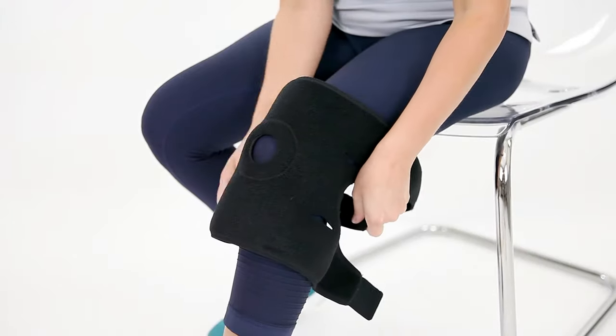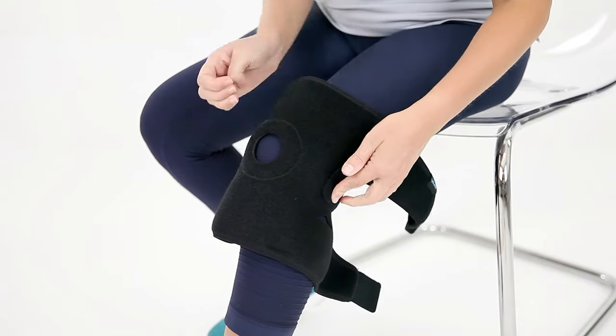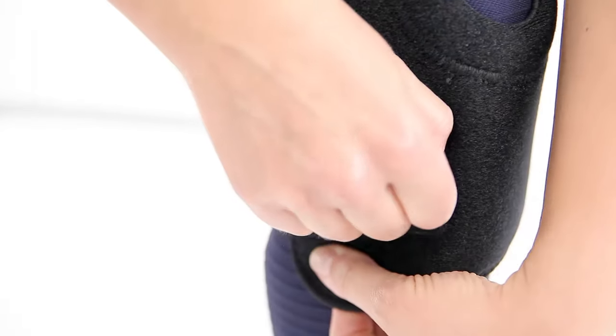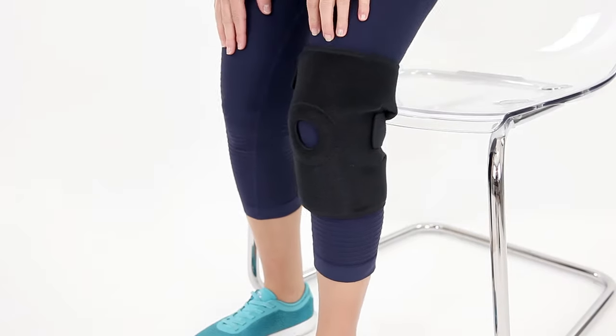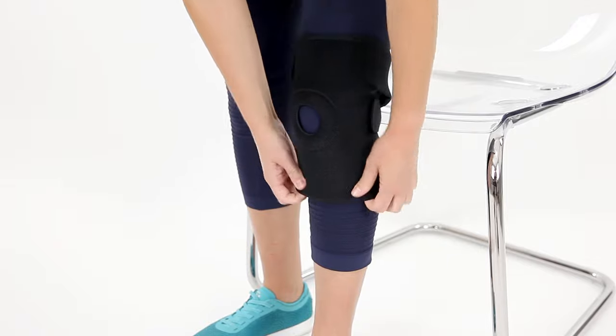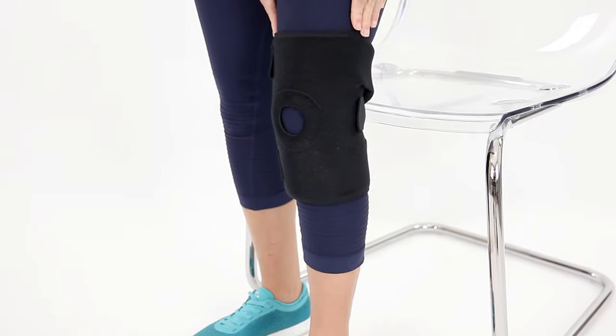Wrap the top strap above your knee and the shorter strap below your knee and secure in place with the fabric fastener. Stand up and test the brace. Adjust the fit to achieve the desired degree of compression and support.